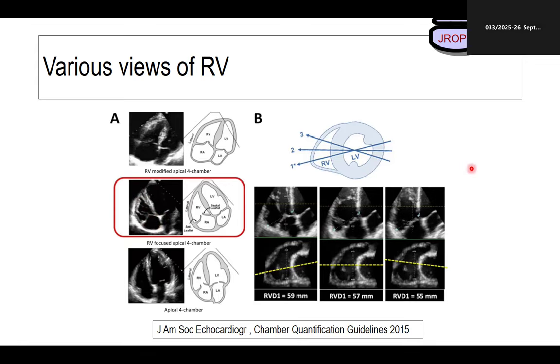Sir, Tushar, roll number 25 this side. In the apical four chamber view, sometimes the left ventricle is on the left side or right side. It depends on the machine, the company of the machine. No, no. The machine remains the same.